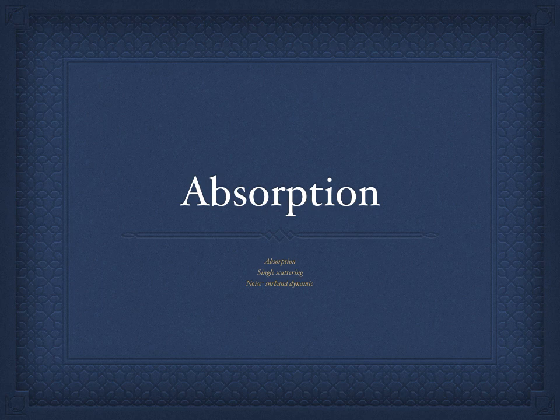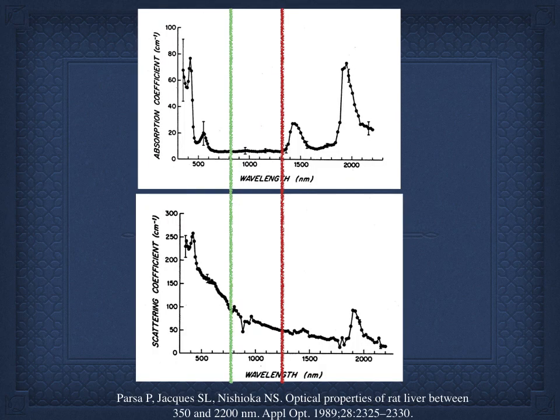The largest absorption is water, which peaks around 1500 nanometers, which is the resonance frequency. And again, we saw this in the paper. If you look at around 1470, 1500 on the top curve, there's a water absorption peak. Hopefully this isn't too distracting, but if we were to shift over the red line to 1700 nanometers, scattering is very low, but we're picking up more absorption than we have at 1300 nanometers, which makes that non-ideal. It's also very difficult to get optics and sources in that 1700 nanometer range, though it's a second option.